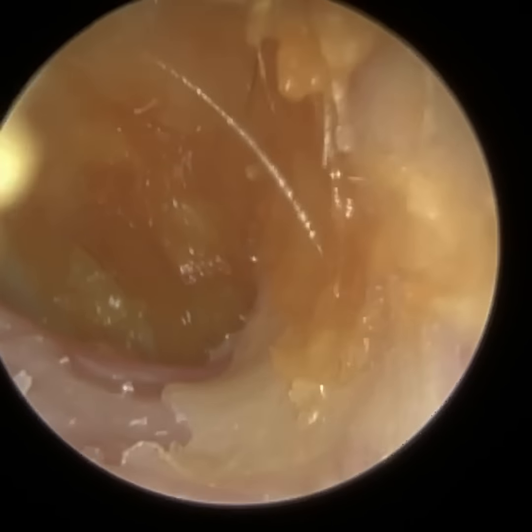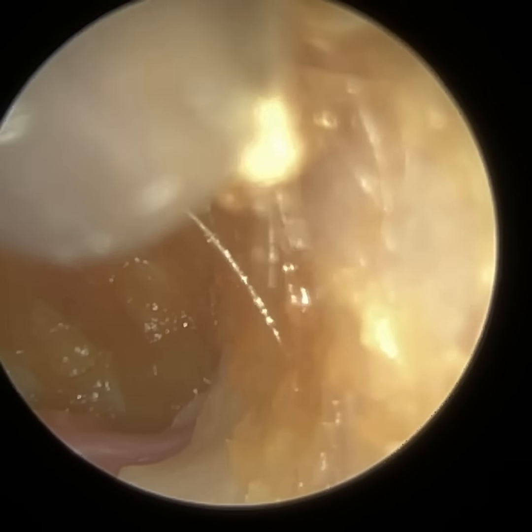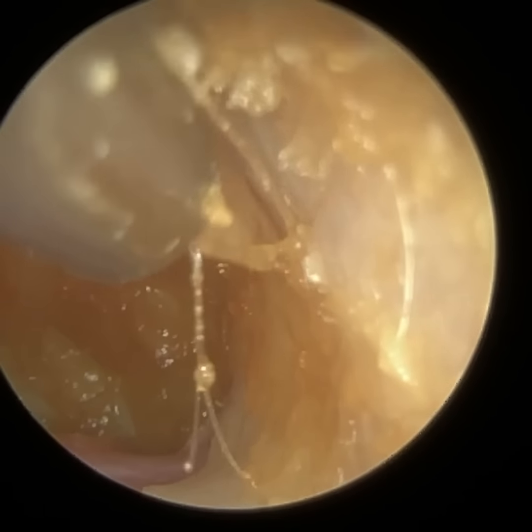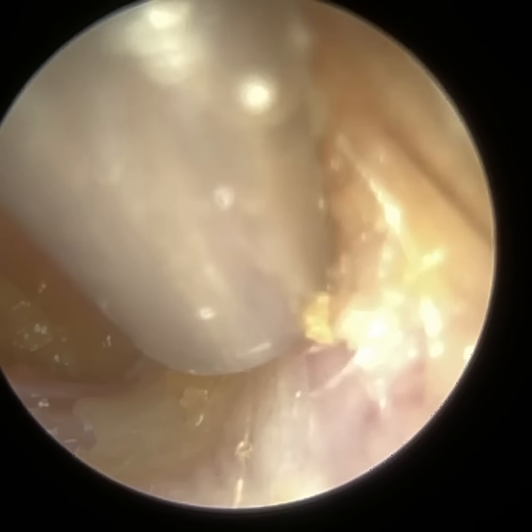And this epithelial skin that we're peeling away here, it's actually dead skin. The epidermis layer of skin actually has its own 5 layers. The innermost layer of the epidermis skin is called the stratum basale, and that's where the skin cells are formed.